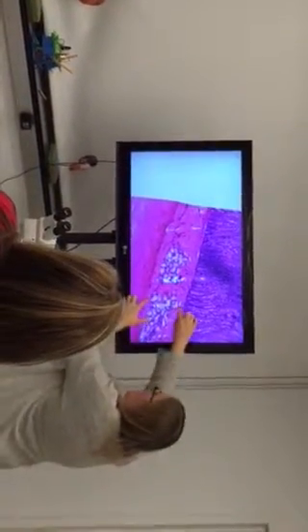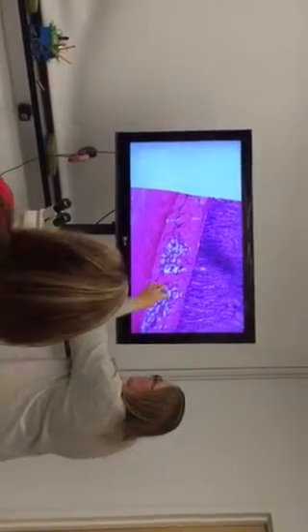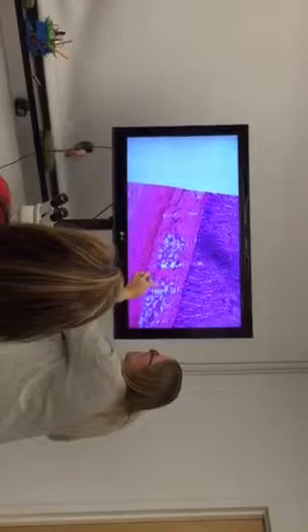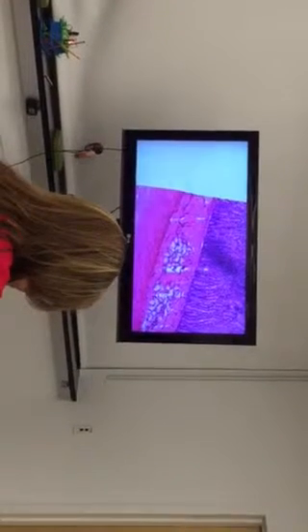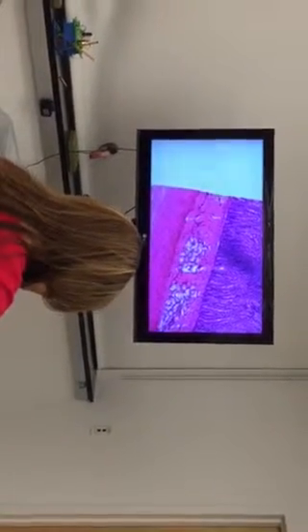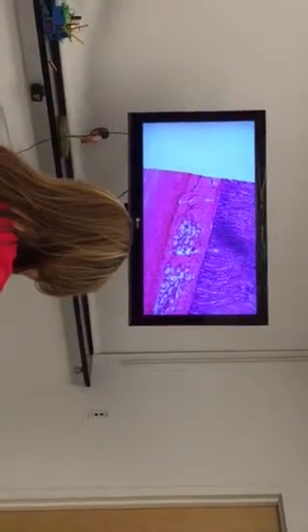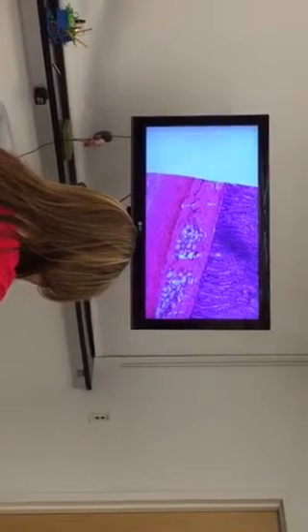Submucosa is from here to here. So you get all to that smooth muscle, which is the muscularis. Yep, this is a gland, the simple cuboidal cells. This is a gland, this is a gland. So that releases additional mucus. There's some enzymes released by the small intestine, but most of them are coming from the pancreas. It's between the smooth muscle and the mucosa. The lamina propria is part of the mucosa.